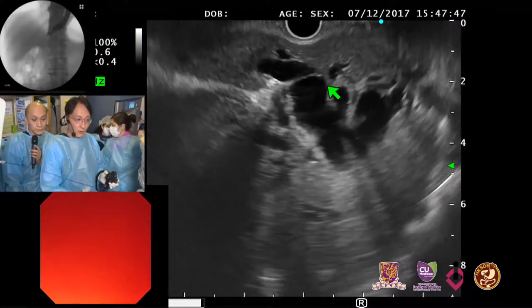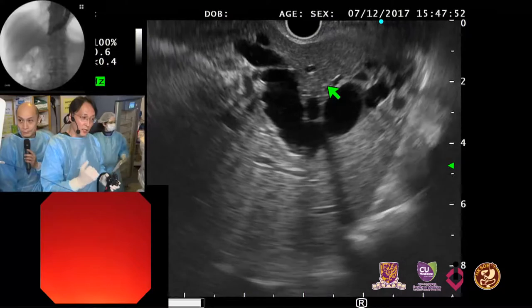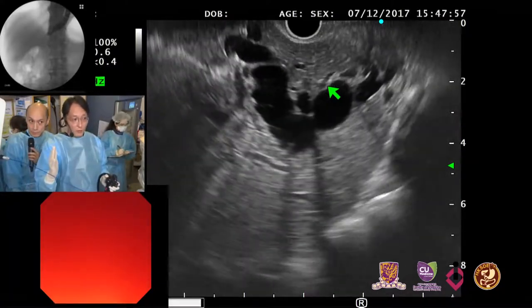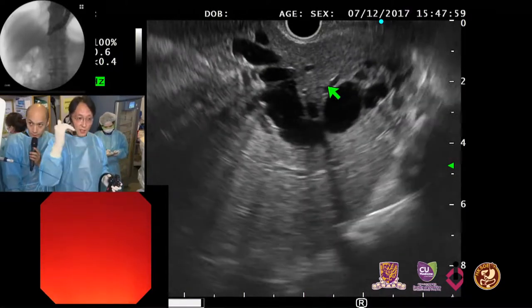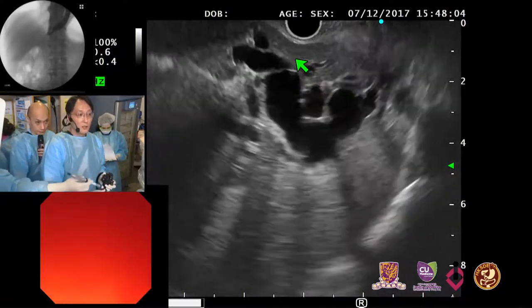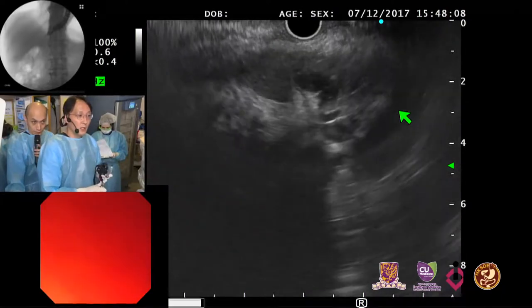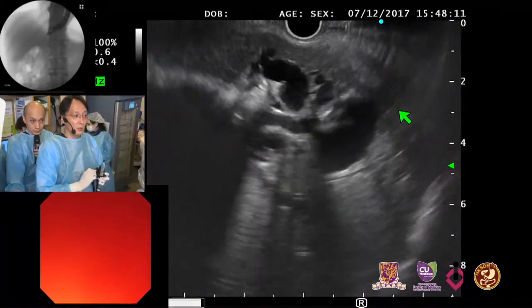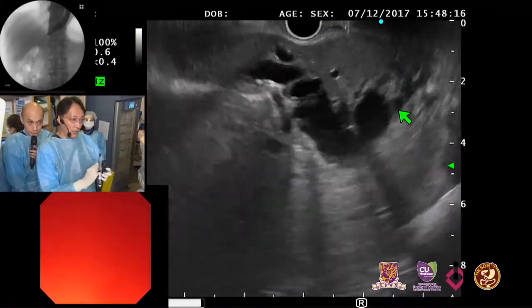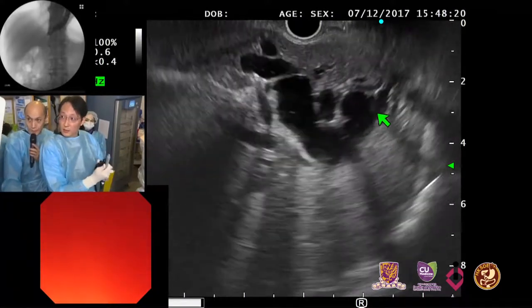Because even though we have a good access point, after insertion of the needle inside the echoendoscope, there is sometimes a shift far away from the access point because there is a stiff needle, maybe a possible chance of some distance between the stomach and bile duct, like this one. And with engagement of the needle, there's a little bit of change of the position. Then I have the small knob and big knob already fixed. Then I use the 19 gauge needle. How about segment two?